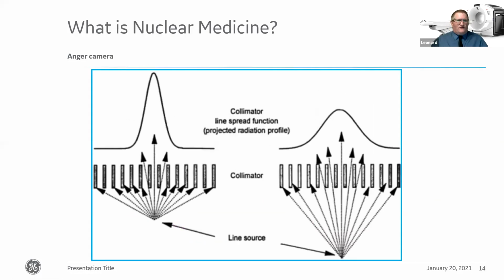I just tried to illustrate a little bit more about how some of the collimators work, but also the impact of looking at imaging at different levels. And again, as we move forwards, the reason for showing you this one specifically is when we come to some of the SPECT imaging, which utilizes a detector that will rotate around the patient, in a similar way to what we do with computerized tomography on the X-ray side of things. Everybody hears of CT, well, we actually have a CT component within nuclear medicine as well.